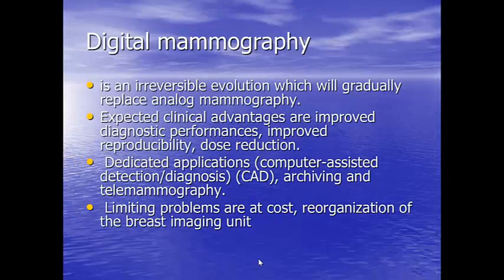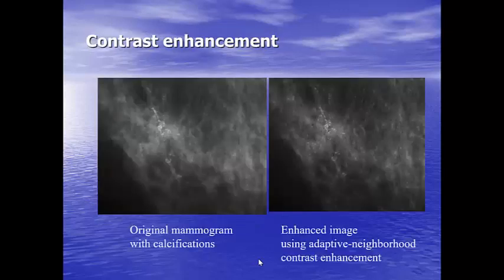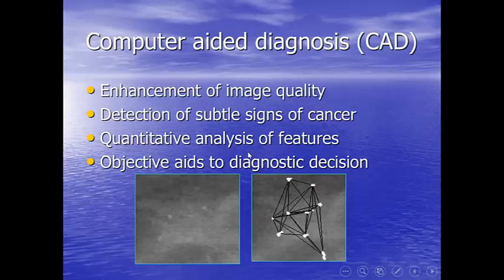Digital mammography, of course, in the digital mammography, the calcifications, some of the images I put, it was long ago from our old machine. It's not digital, but we can see the calcifications by this machine also. And then now there is the dedicated computer-assisted diagnosis and the telemammography and archiving. All these are better resolution, and we can get the better assessment of the microcalcification like in these two cases. And then the computer diagnosis or the artificial intelligence, which can detect subtle changes of cancer.